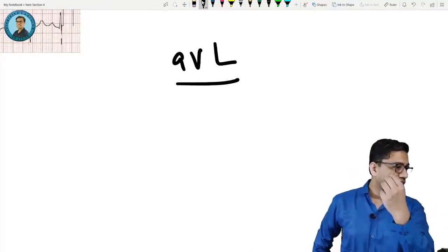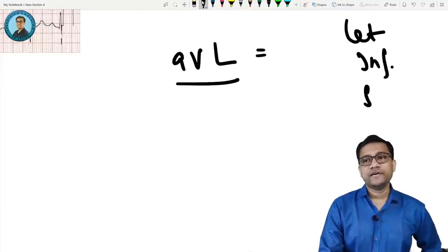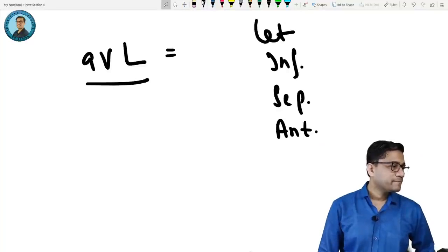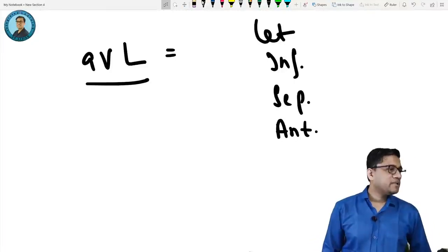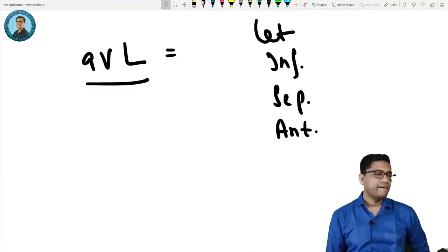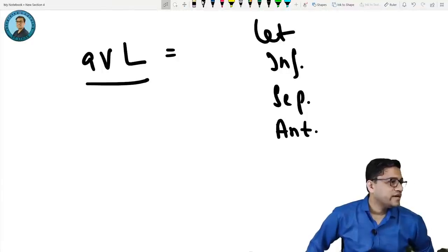So, AVL, which one? AVL. I am giving options: lateral, inferior, septal and anterior. So, AVL belongs to which category? AVL. Yes, very good, Shishma. First to answer. Other people? AVL. Lateral, lateral, Sindhuja, Atul, very good. Priyanka, yes, it is lateral. Very good, okay. All of you gave it right.